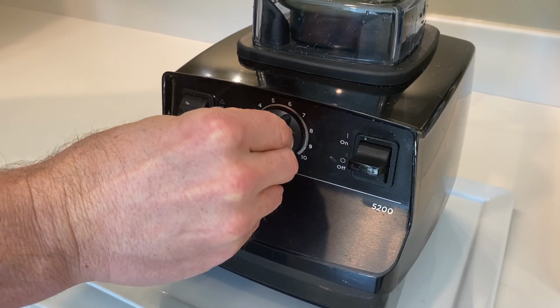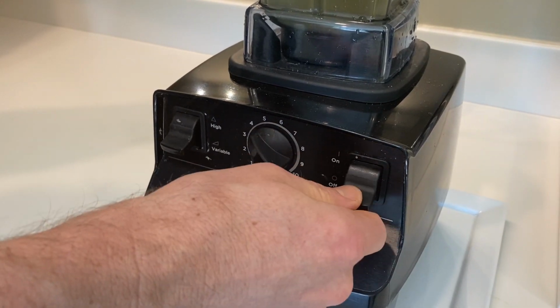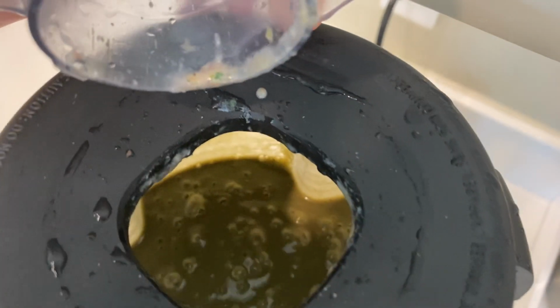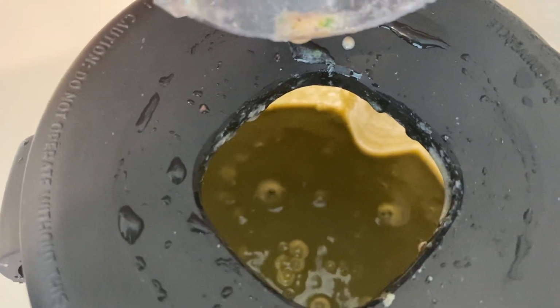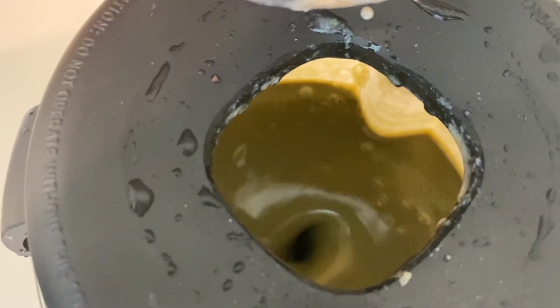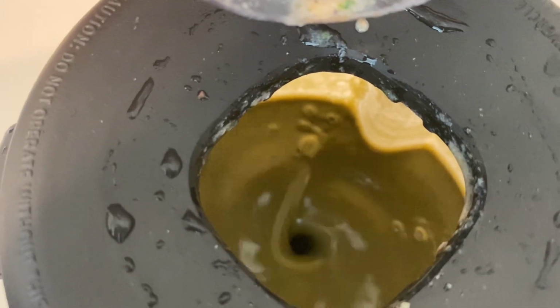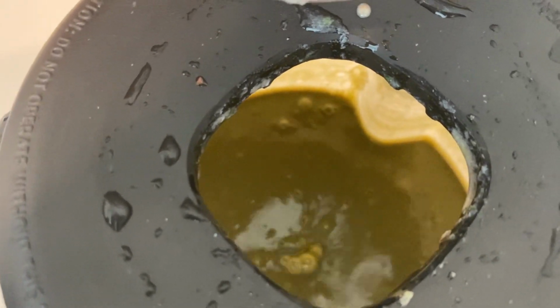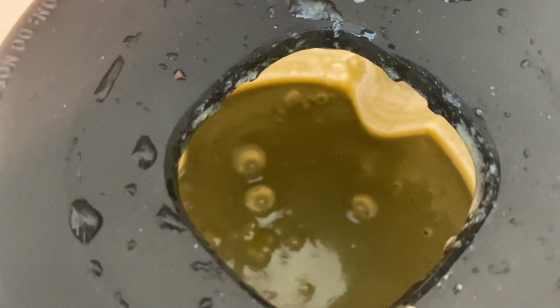Then you want to move the dial from high to variable, and turn the variable knob slowly down. You want to turn the machine off and then on again, off and on several times, and that gets the air out of the blended mix. You can see when we stop, the air bubbles come to the surface. It's important to get the air out of the blended food so that it doesn't go in your loved one's stomach.